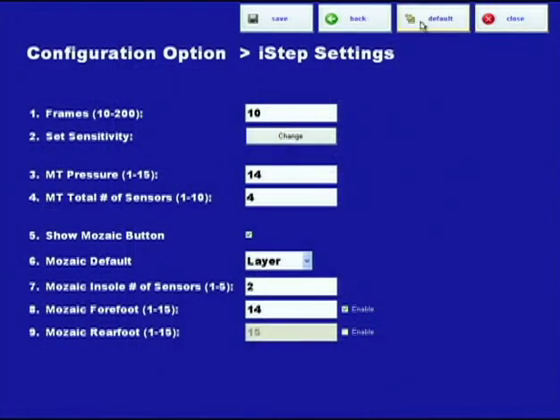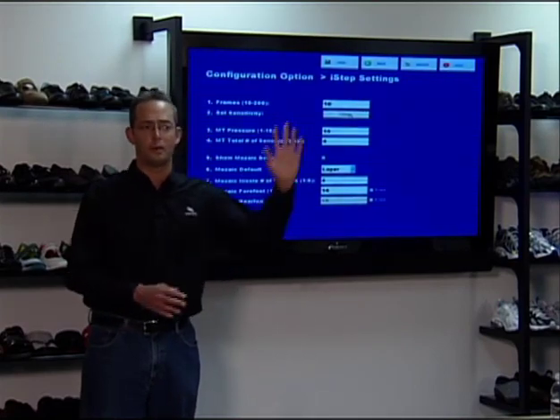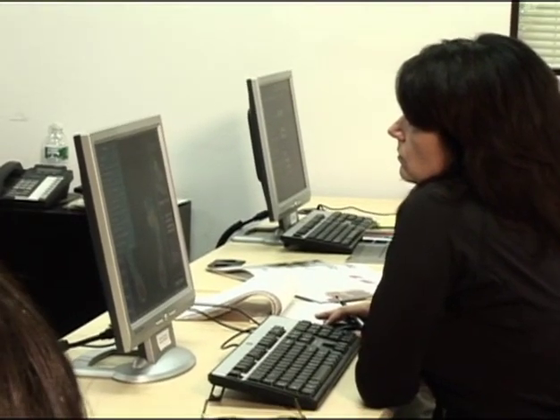On this screen, if you hit default, it will go back to the original settings, which were 14 and 4. It will bring the frames countdown back from 11 to 10. Any questions on met pressure, total number of sensors, and how we determine whether the LYNCO should have a met pad? Pretty easy. Next is Mosaic.